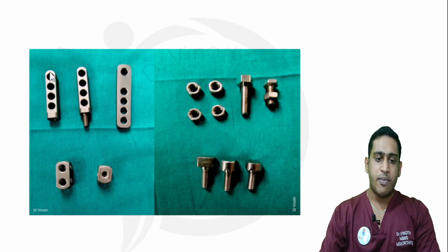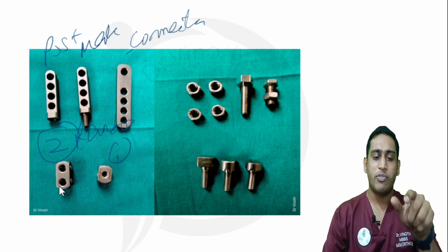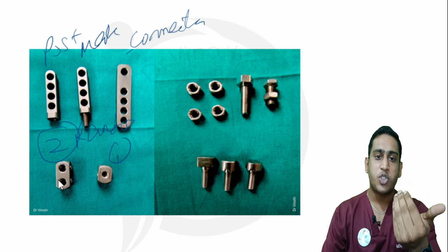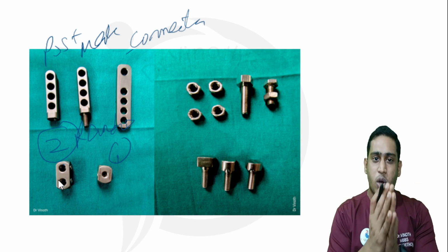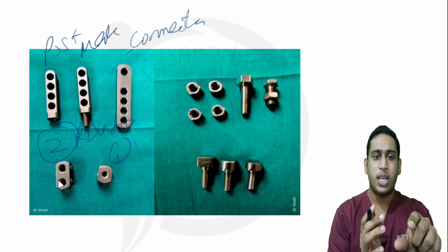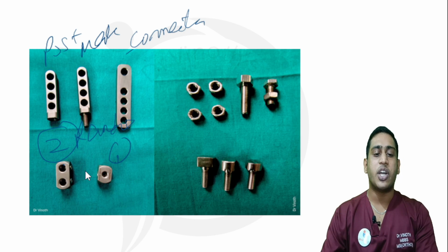So this is called a female post, this is called a male post, this is called a connection plate or a connecting plate, and this one is called a rancho. This is a single hold rancho and this is a two hold rancho. Through the rancho we sometimes fix for extra stability or extra hold at the fracture site or at the bone surface. We will be putting the SCHANZ pins. For the fixation of the SCHANZ pins we will require this rancho, R-A-N-C-H-O.